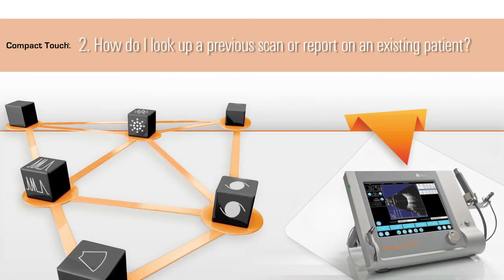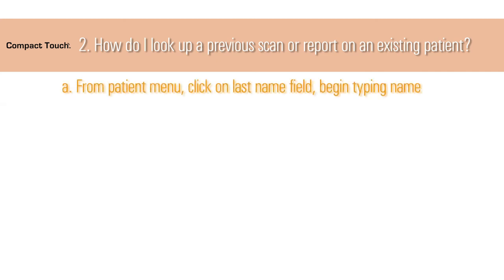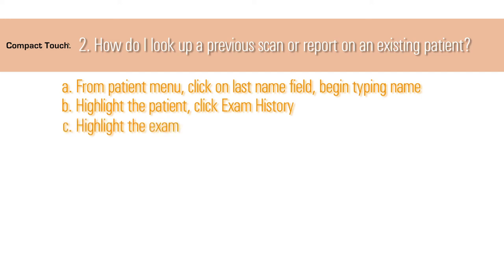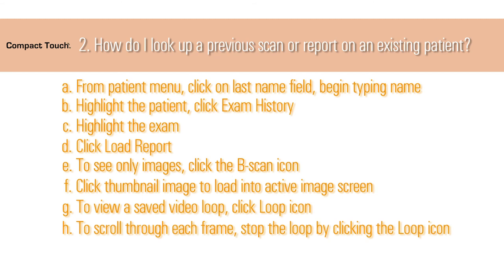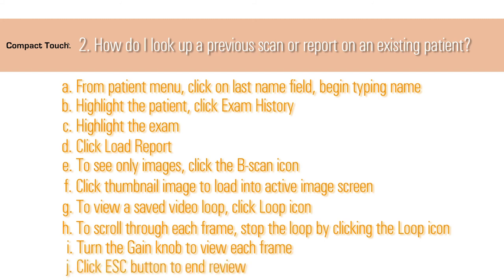2. How do I look up a previous scan or report on an existing patient? From the Patient menu, click on the Last Name field. Begin typing the last name. A list of patients whose last names begin with the first letter will populate. Highlight the patient you are looking for and click the Exam History icon at the bottom of the screen. A list of all exams for this patient will populate. Highlight the exam you wish to review. Click on the Load Report icon. If you wish to see only the images, not in report form, click on the B-scan icon at the bottom of the page. Click on the thumbnail of the image you want to see. This will load the image into the active image screen. If it is a saved video loop, click the Loop icon left side of the screen. This will activate the video. To scroll through the loop frame by frame, stop the video by clicking the Loop icon again, then turn the Gain knob on the machine. To end your review, click the Escape ESC button.